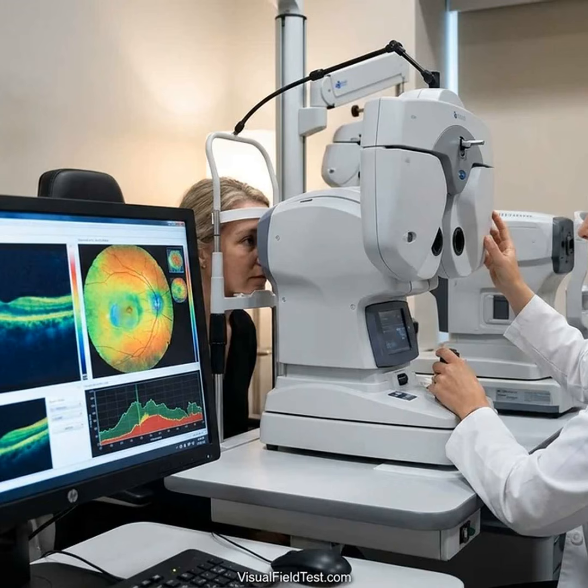In early glaucoma, combining OCT trends with risk factors, pressure trends, and disc appearance gives the best guidance on how aggressive treatment should be. Important OCT findings in moderate glaucoma. Moderate glaucoma, stage 2, is when clear field defects are already present, but not yet end stage. Both OCT and visual field changes are typically seen. In this mid-stage, trend monitoring on OCT becomes crucial. Doctors watch for continuing RNFL or ganglion cell layer thinning. A small thin spot in one check may become more obviously thin at the next.